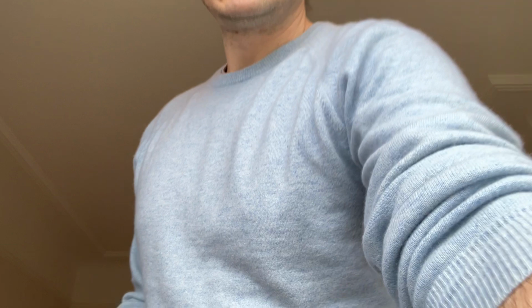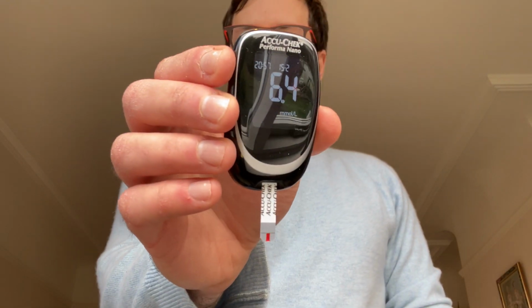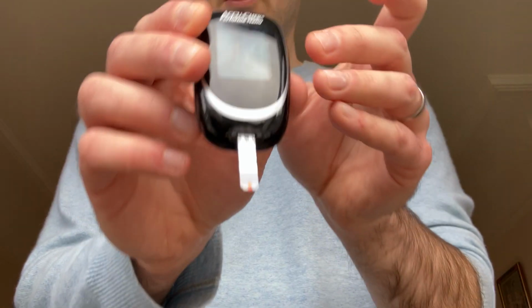So I still have a bit of blood there. It's not really painful, it's not really pleasant. And I'm lucky not to be diabetic, but if you're diabetic, you'll have to do this multiple times a day. But the beauty is that within seconds, from myself pricking my finger to getting a result, you can go from an analyte in blood to an electronic readout that tells you exactly the concentration of glucose in blood.